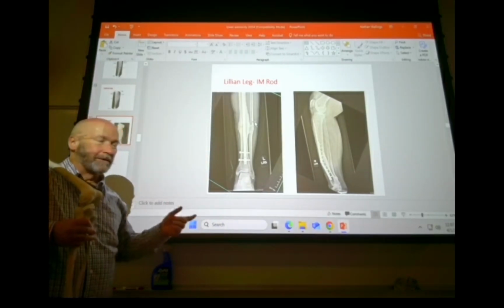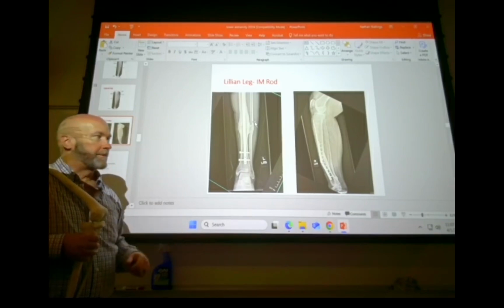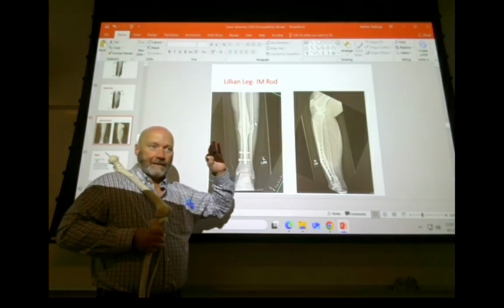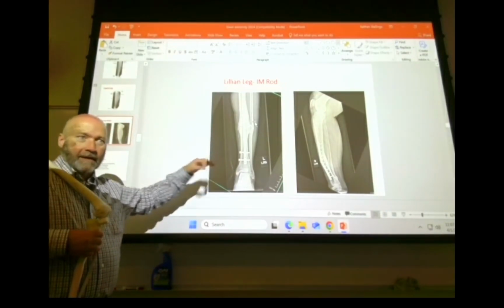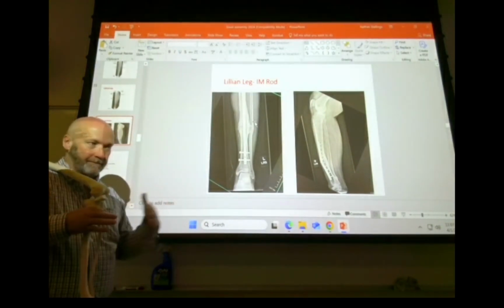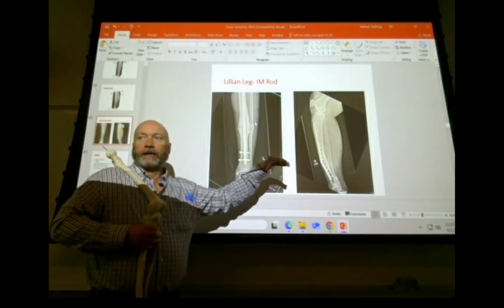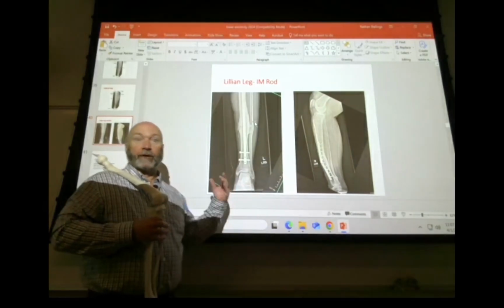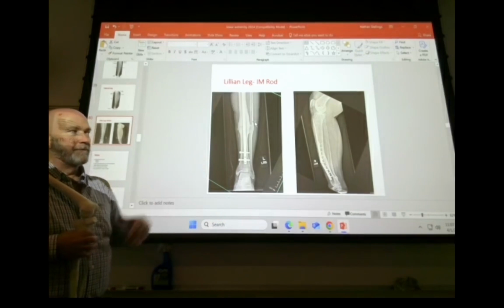You've got to unlock all the locks on the C-arm and adjust things until it shows up in a perfect circle. So perfect circle, center of the screen, again because of the divergent central ray. If you're not in the center of the screen, then you're using the divergent central ray and you've got parallax going on. So you have a perfect circle, not in the right place. So very, very tough.